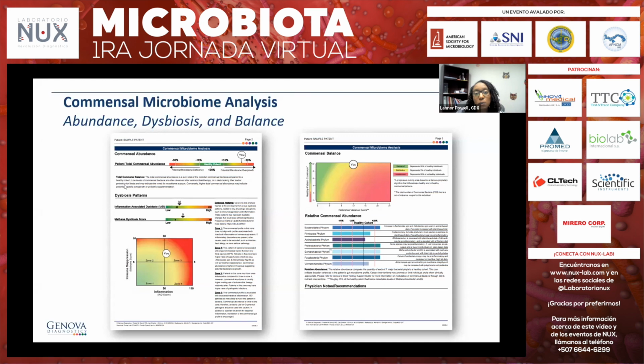Based on the dysbiosis patterns, you're put into zone 1, 2, 3, or 4. In zone number 1, you can see it has low methane, low inflammation. Zone number 2 would be higher methane, but lower inflammation. Zone number 3 would be high inflammation, high methane, and zone number 4 would be high inflammation, low methane. We do provide that insight on the right-hand side of our report, a little bit of commentary, so you don't have to remember what these different zones mean.